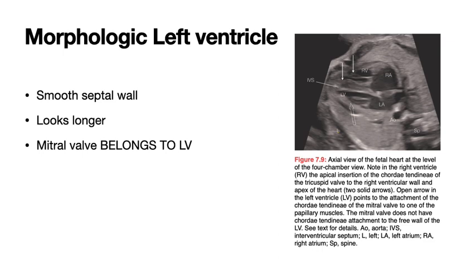And in the picture on the right, you have to look carefully, but there is a papillary muscle, a thick thing coming off the septum. But if you go on to the other side, it's smooth. The entire septal surface is smooth. And then, just like I said, the tricuspid valve belongs to the right ventricle. The mitral valve belongs to the left ventricle. They always travel as a package.